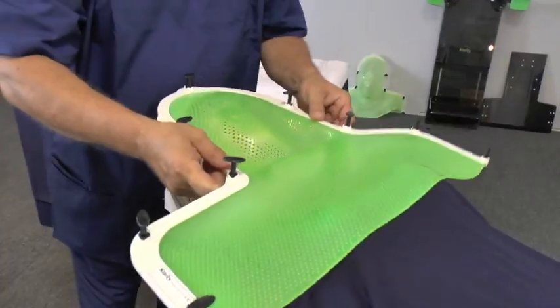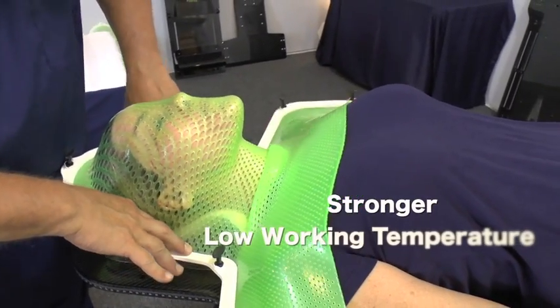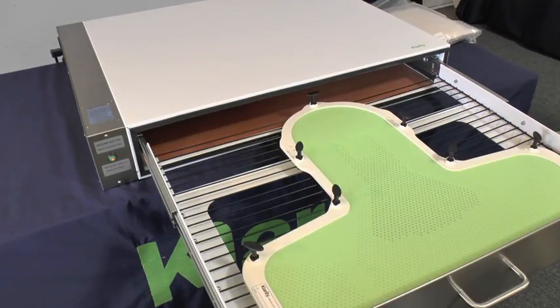Simply stretch the mask back into the shape you need. Clarity Green masks are stronger than traditional RT thermoplastics, and they have a low working temperature.